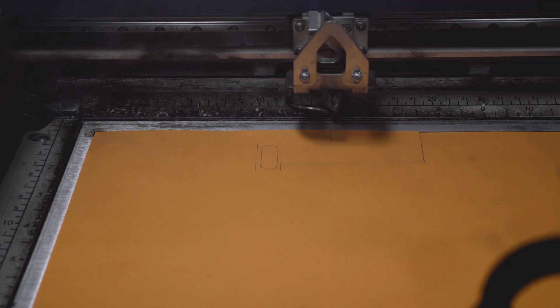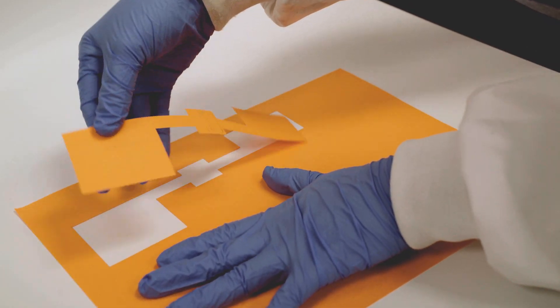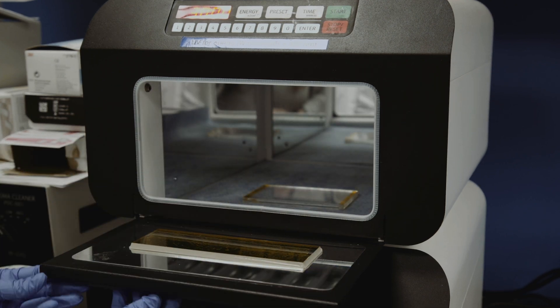To address these challenges, our team has developed a multifunctional origami-inspired tissue sealing patch with a novel multi-layer architecture.